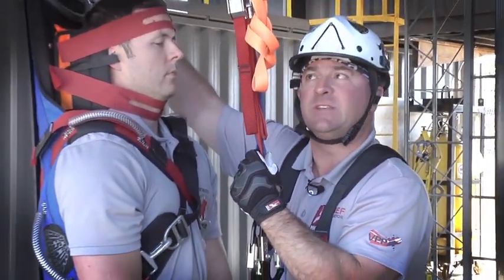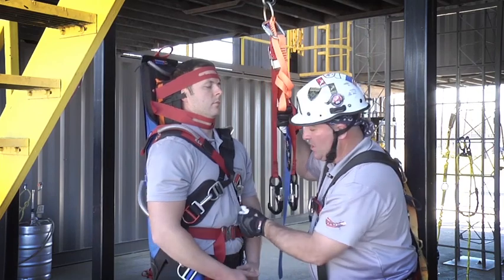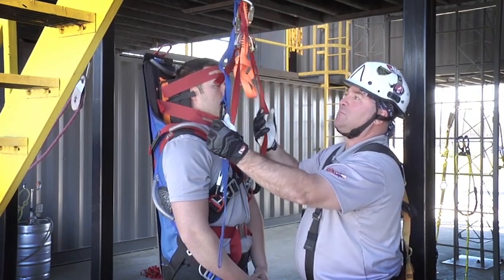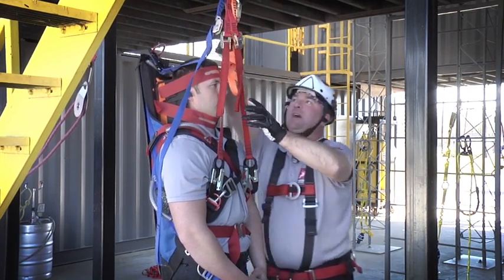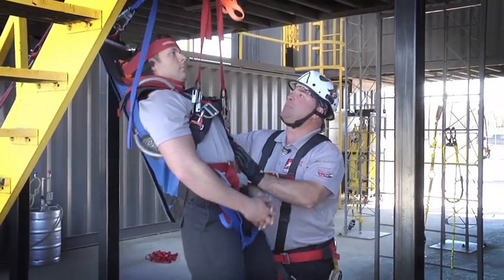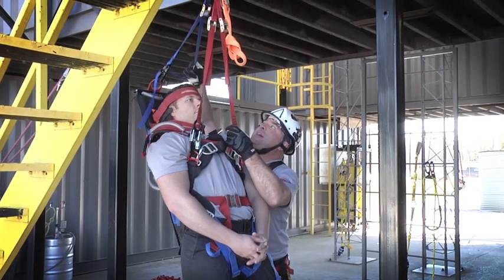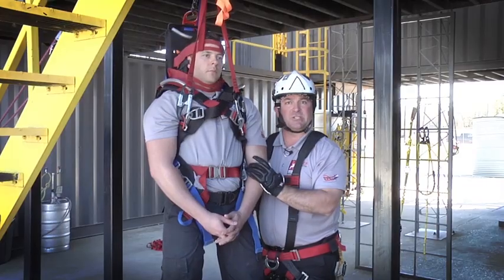In addition to lifting from the bull ring, this device also comes with a lifting bridle. I have two red straps that correspond with the two red D-rings on the front of the device — I'll connect these two first. Then it comes with a blue strap designed to connect to the back of the bull ring. Lastly, there's an orange strap, which is used if you're going to use it with an attendant. As we load this system up, notice it's going to be in a semi-vertical position — a comfortable ride, but most confined spaces won't allow us to negotiate that hole. If we bottom out the blue strap by pulling it down, that gives us a nice upright vertical position to get that patient through the small confined space.